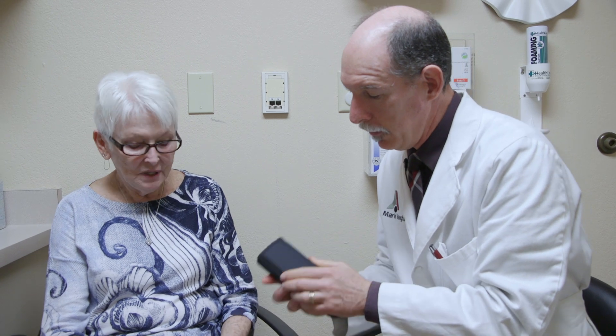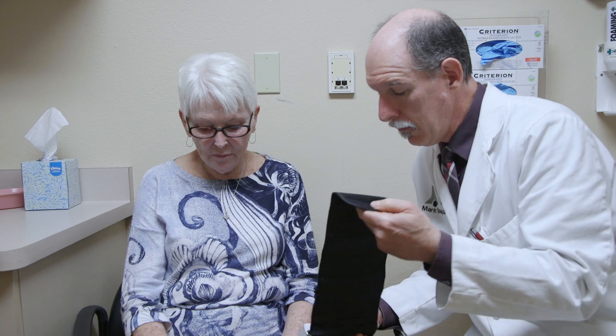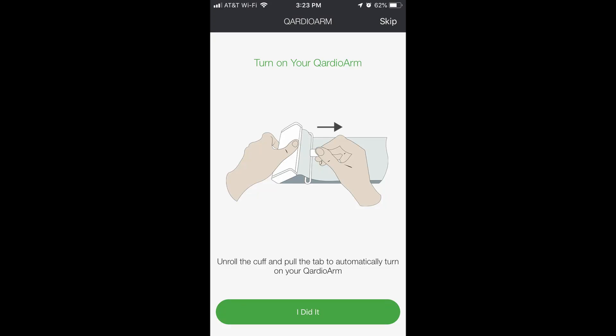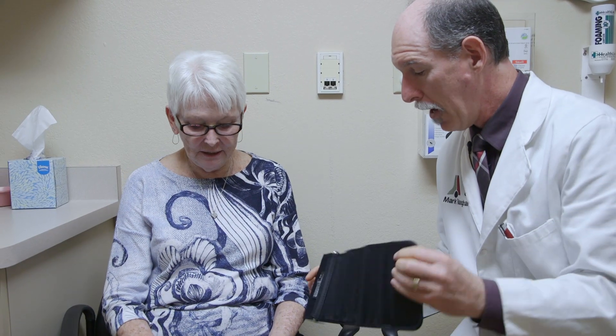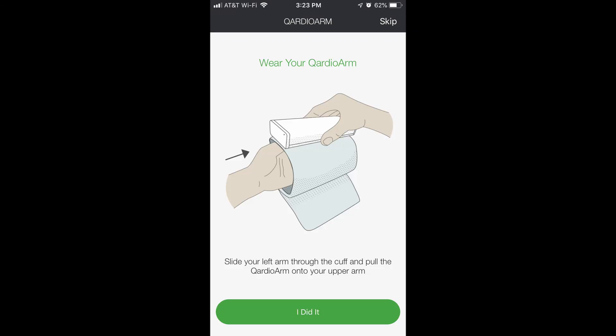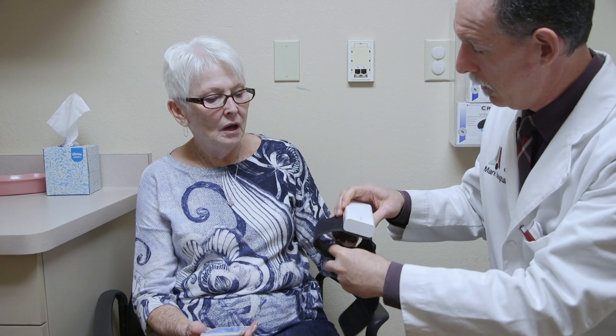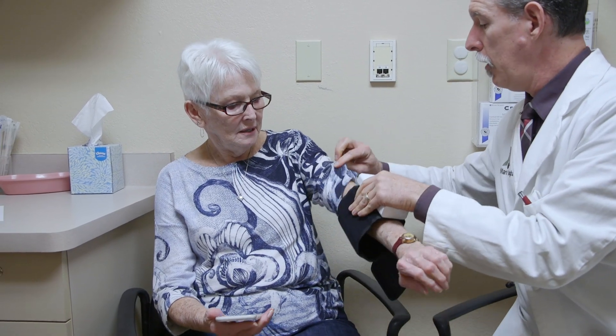What does it tell us to do? It tells us to turn it on — unroll the cuff and pull the tab to automatically turn on. We have a green light. Now we put it on the arm, preferably the left arm, with where it says 'Cardio' pointing towards your hand, and preferably no sleeves.